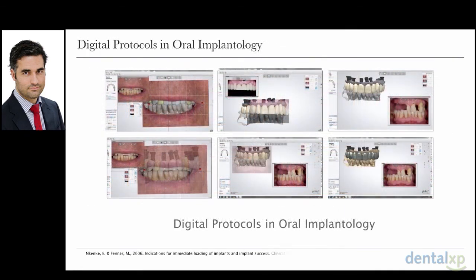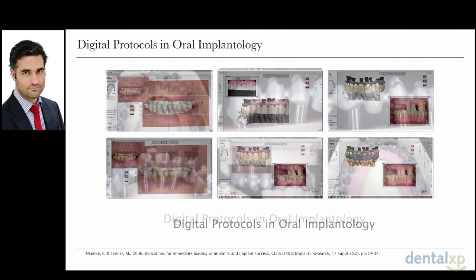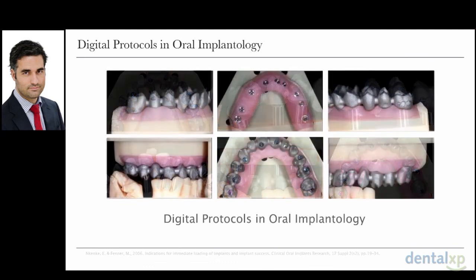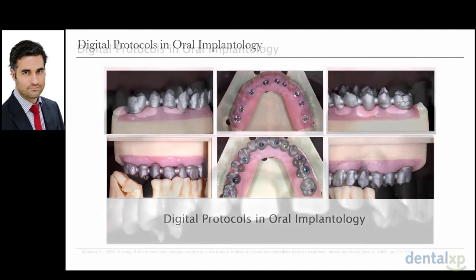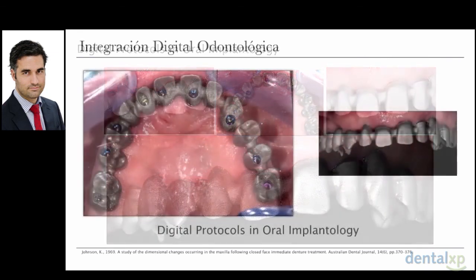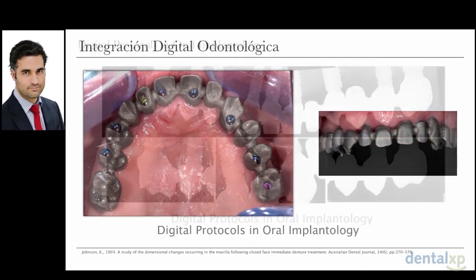And after that, the framework was built. This is the framework. As you can see, a beautiful framework in CAD-CAM. It arrived, and when it came to the office, we did a test and it was okay. It was a fantastic day for me and for all the team, because we were amazed with the result of the framework and the digital impressions.